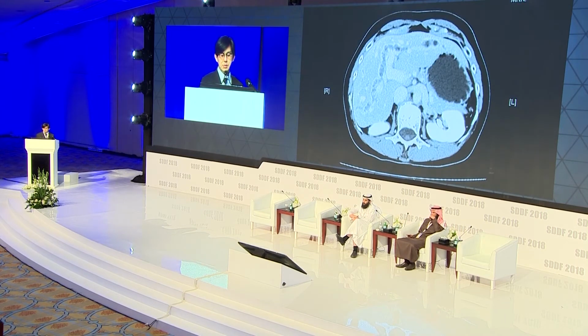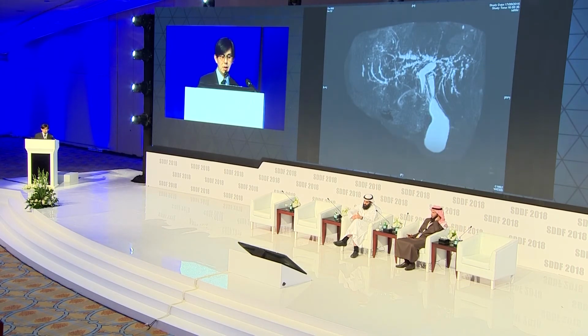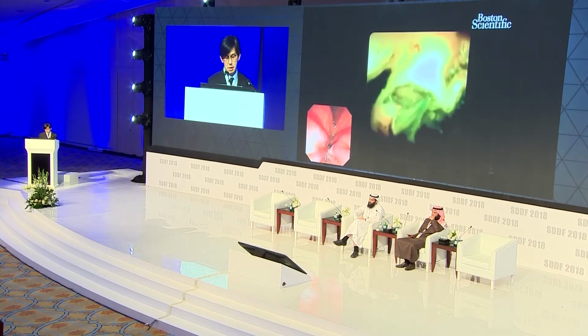The use of the SpyScope is often quite useful in looking at some filling defects. A case referred from outside hospitals with multiple filling defects within both intrahepatic ducts and saccular dilatation of the intrahepatic ducts. And this is the MR. There were a number of diagnoses being put forward, such as sclerosing cholangitis, some kind of atypical Caroli's disease, and so on. And we put in an endoscope, and when we injected contrast, the contrast wouldn't go up to the intrahepatic duct.